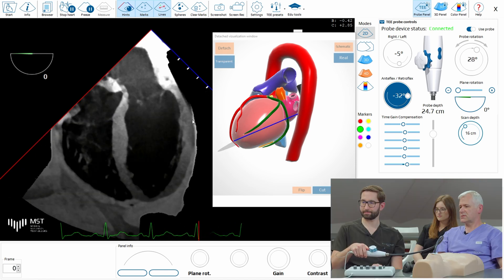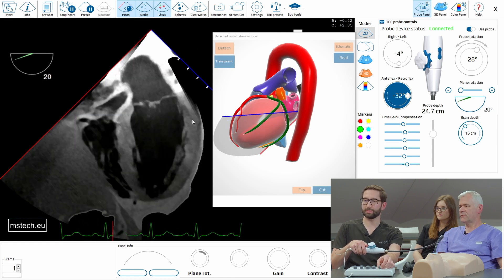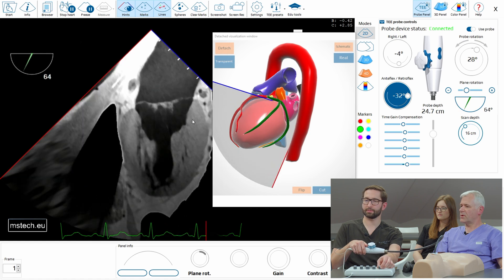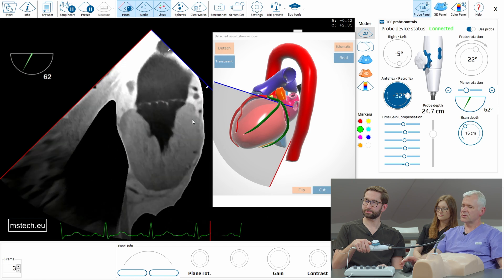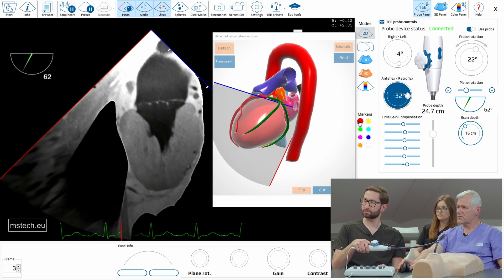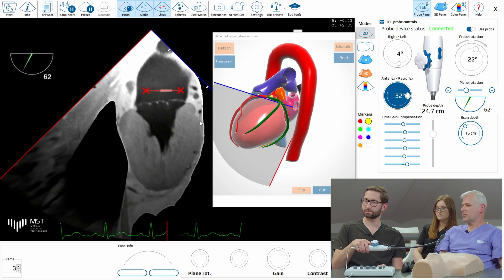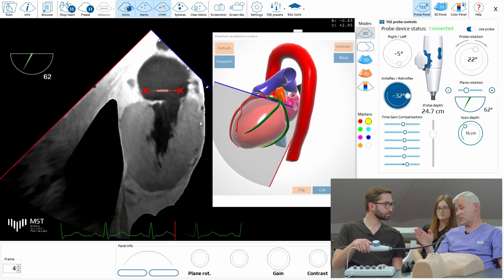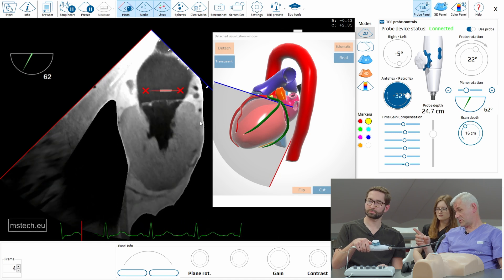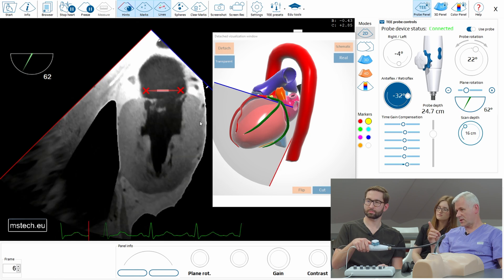This is a four-chamber view. Now let's go to intercommissural — just changing the plane to 60 degrees. So let's check if you are correct. Now what do you select? You can either increase the angle to see the long axis view with the LVOT — we call it the LVOT view. Add 90 and you will have 150, or press the button.